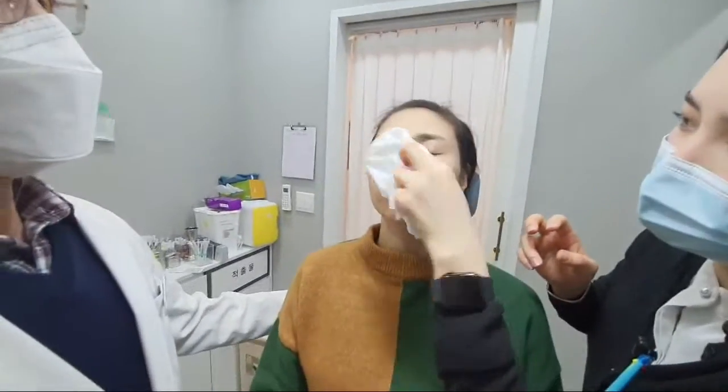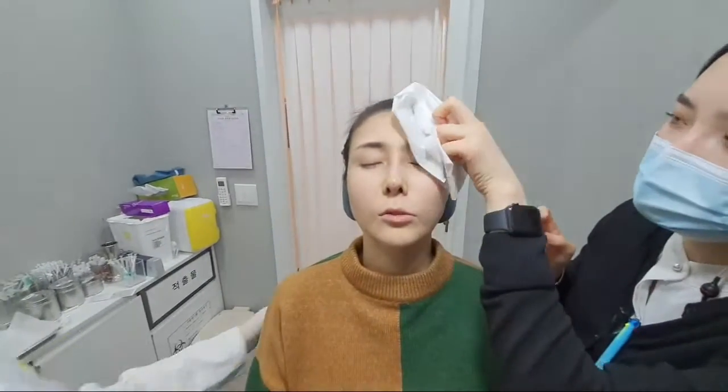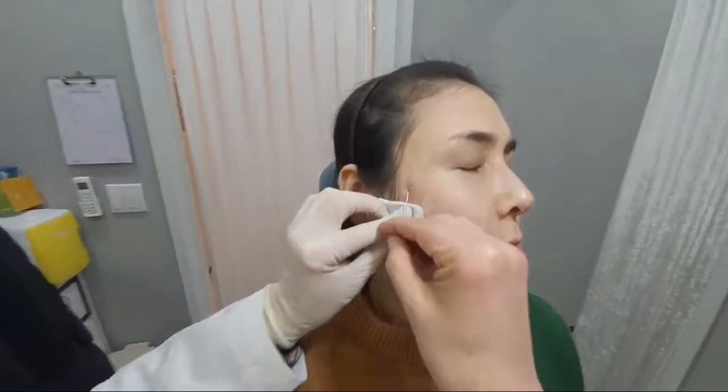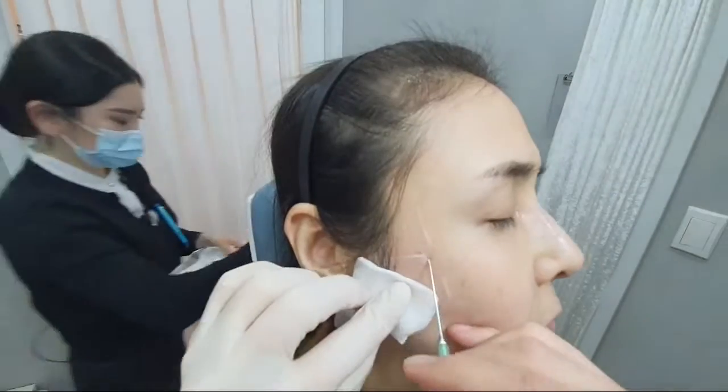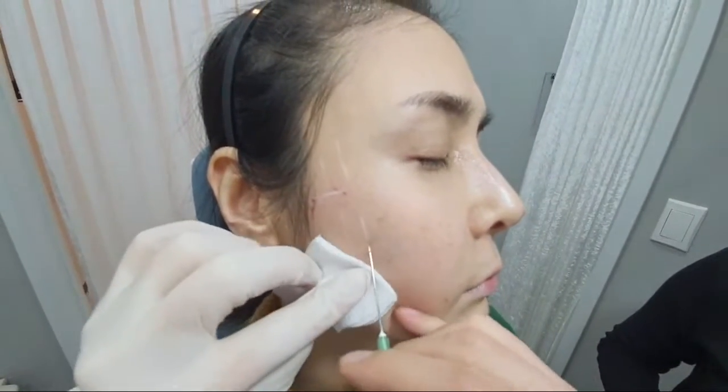좀 어지러울 것 같은데? 괜찮으세요? 어지럽죠? 아까 조금 맞았어요. 조금은 나은데요. 현기증 나서 지금 조금. 이 사람은 좀 쉬고 네. 이쪽만 먼저 하고 끝냅시다. 네, 살짝 그렇게 되시고 편안하게. So making that punching injection at the site.